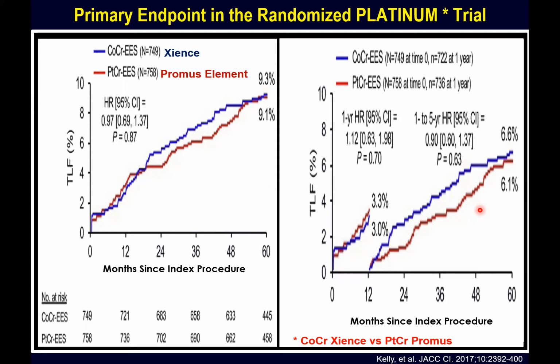I think any of you that are old enough to have put in Mirage stents remember the geometric distortion of the vessel. I think it's intuitively unattractive and not something linked to fracture. We know that. So I think in general, although I can say the theory is very good, the hard data and support are just not there yet. It's not something I've given up on.